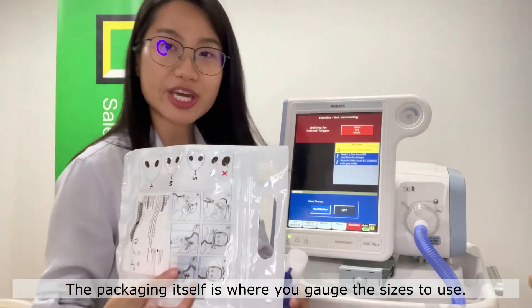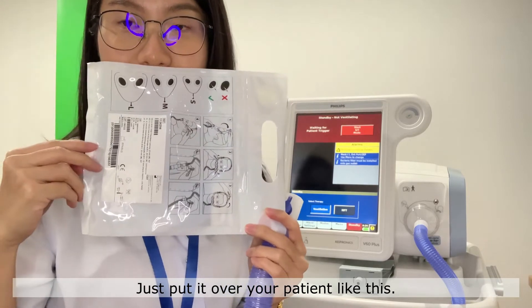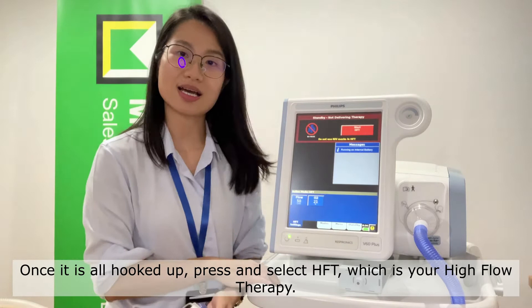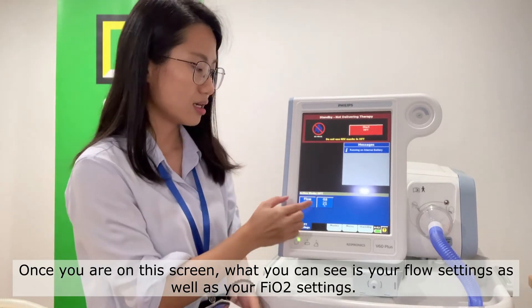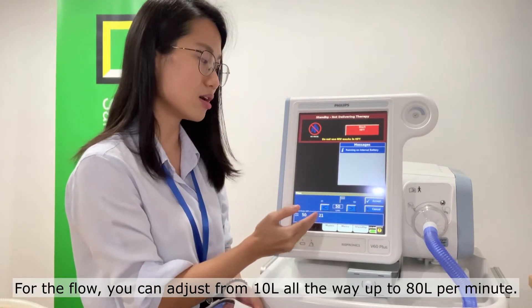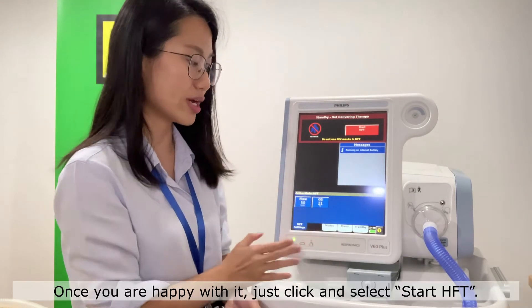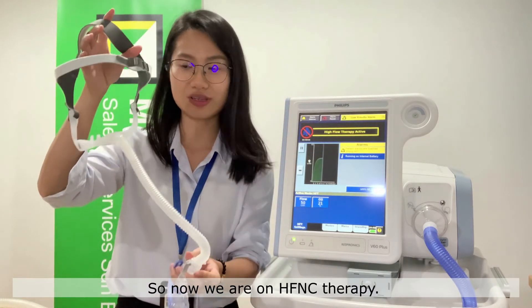The packaging itself is where you gauge the size to use — you can see S, M, L marked on it. Just put it over your patient like this. Once it's all hooked up, press and select HFT, which is high flow therapy. Once you're in this screen, you can see the flow settings as well as your FiO2 settings. For flow, you can adjust from 10 liters all the way up to 80 liters per minute. For FiO2, you can adjust from 21% all the way up to 100%. Once you're happy with the settings, click and select Start HFT. Now we are on high flow nasal cannula therapy.